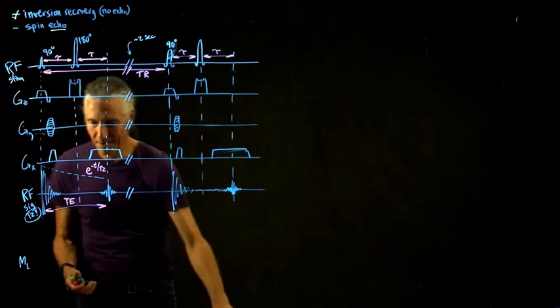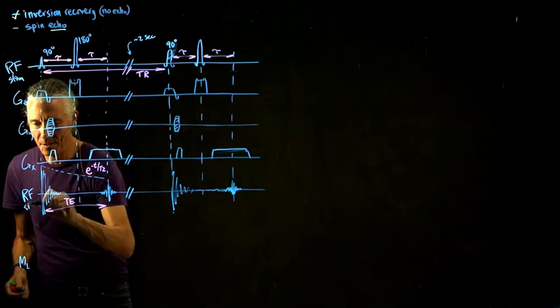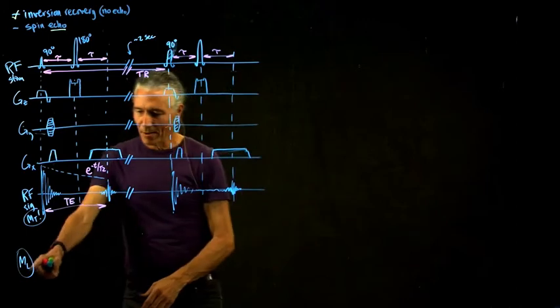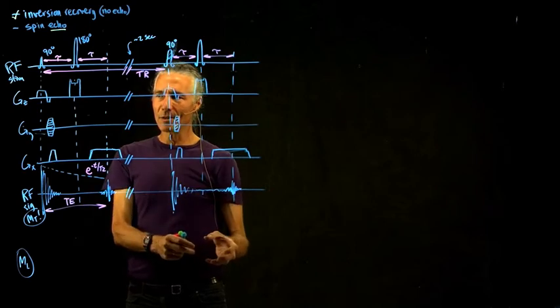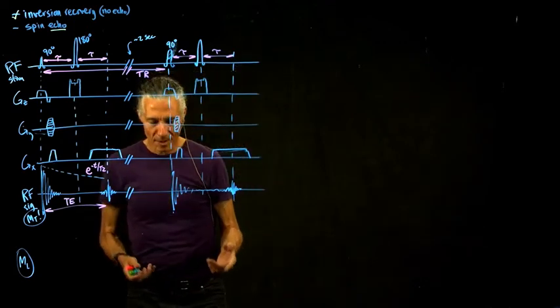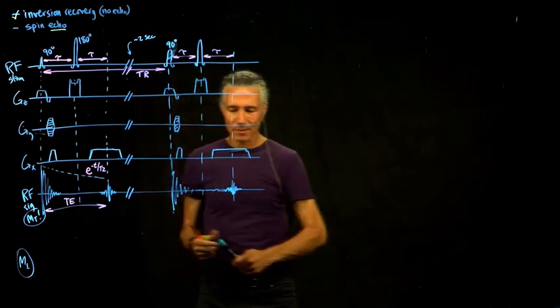Or just, not T2, what I meant was transverse magnetization. So this graph is the RF signal, so that's MT. But now we're going to, for the most part, concern ourselves with the longitudinal, because that's the one that we're sort of preparing, and at the last second we turn it into transverse and then record it after accounting for the T2 decay. So most of the action in the equations will be from dealing with the longitudinal recovery, the z-axis recovery.